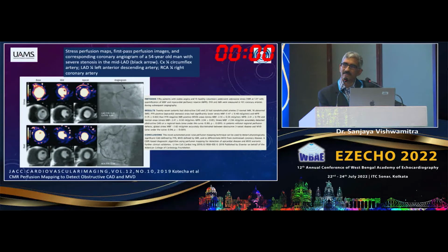What additional information can CMR give us? So I've walked you through ischemia, I walked you through infarct, I walked you through the combination of both, and I walked you through some basic sequences earlier. Is there something else that we can do other than T1 mapping and T2 mapping, other than looking for microvascular obstruction, hemorrhage within that particular area?